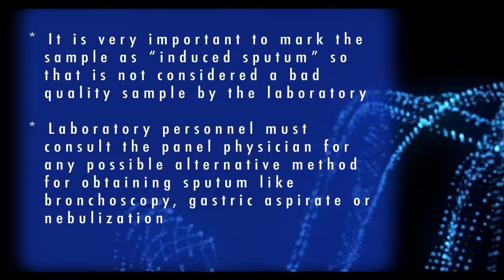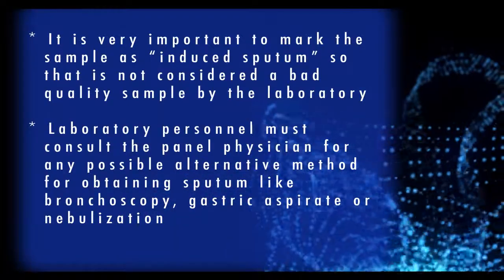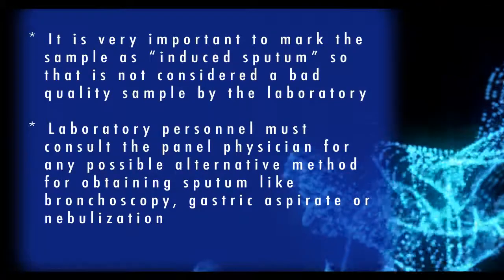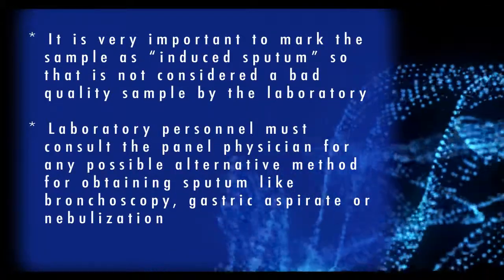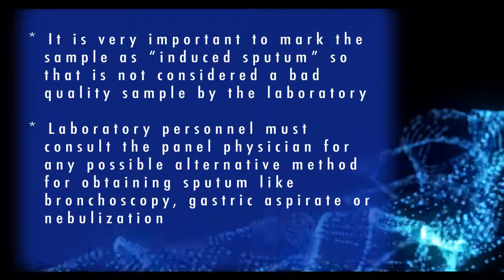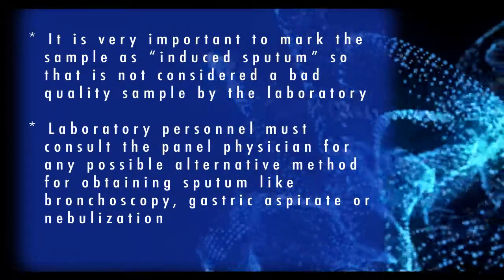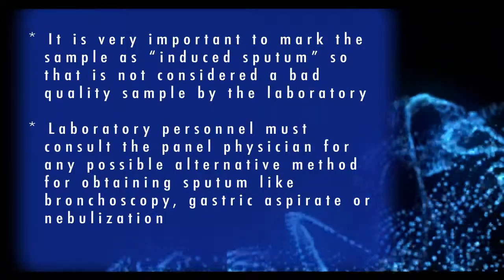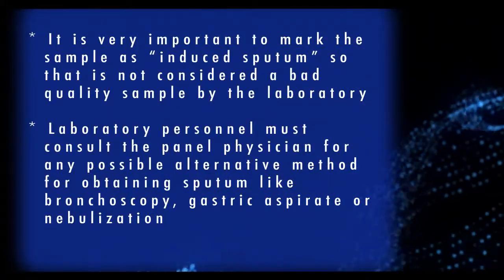It is very important to mark the sample as induced sputum so that it's not considered a bad quality sample by the laboratory. Laboratory personnel must consult the panel physician for any possible alternative method for obtaining sputum, like bronchoscopy, gastric aspirate, or nebulization.